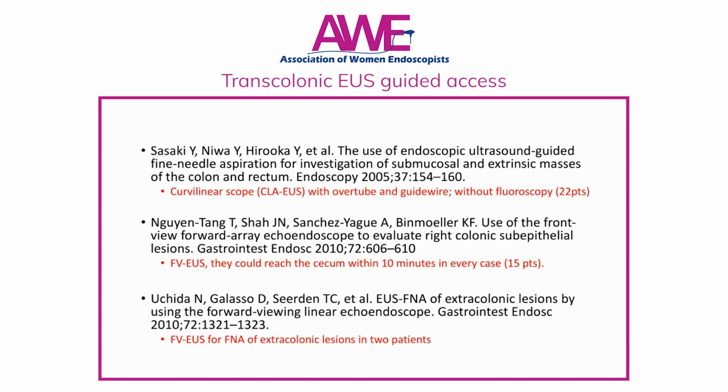And then in 2010, Ken Bin-Muller's group was one of the first to use the forward-viewing Olympus echo endoscope to evaluate right colonic subepithelial lesions. And this was in 15 patients, and they could reach the cecum within 10 minutes in every case.